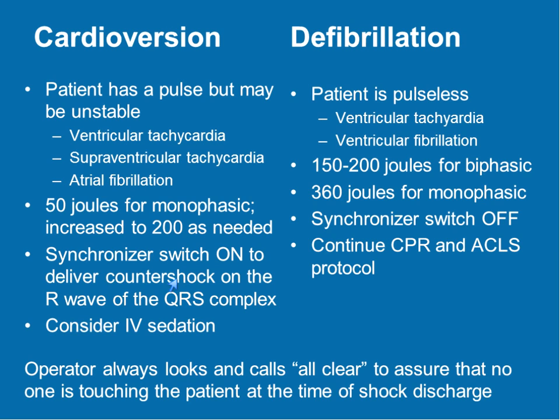pulse, cardiovert. And the difference between these two things is the sync button. Sync button on is cardioverting. Sync button off is defibrillation.